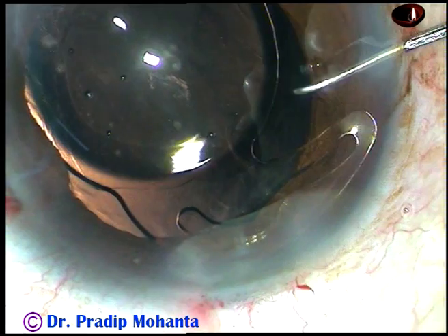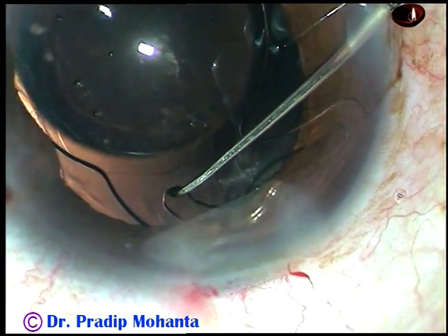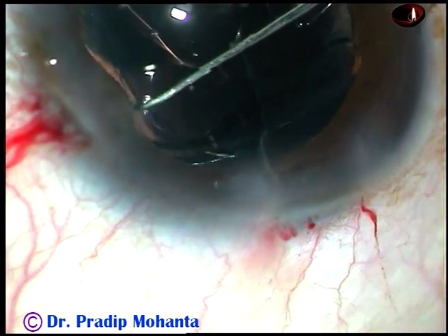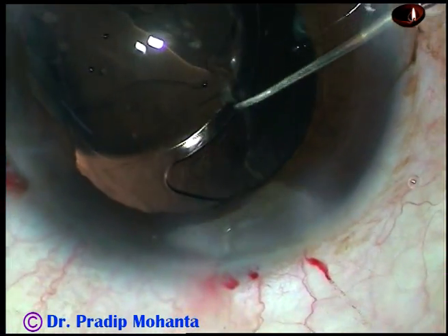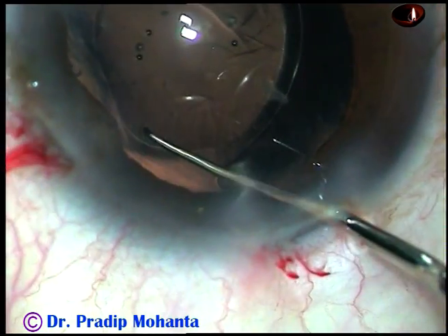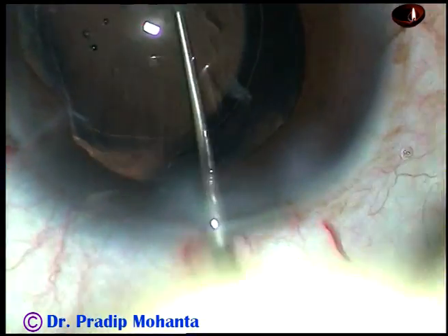Now the Sinskey hook goes through the side port. The trailing haptic is pulled towards the center and then pushed backward — that is, towards the posterior capsule — and the haptic goes into the capsular bag.